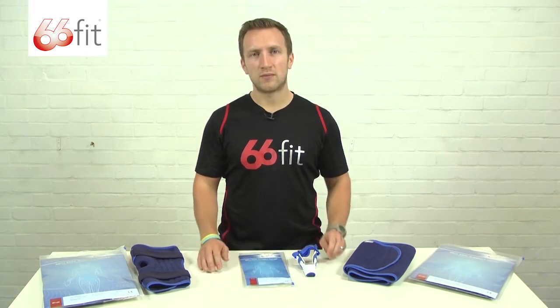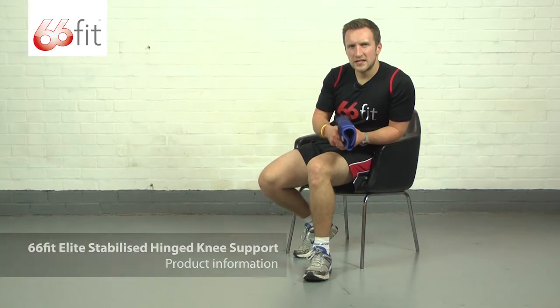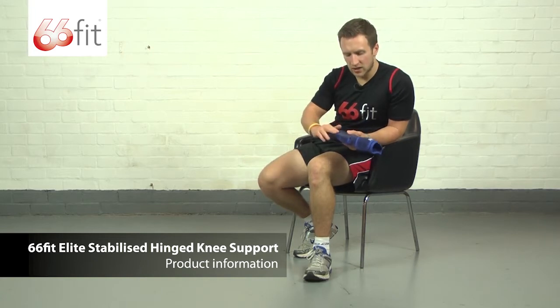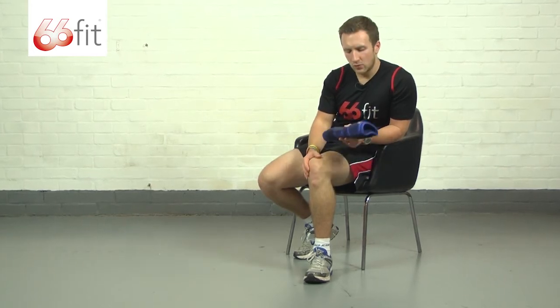I'm now going to show you in a bit more depth one of those supports. This is the 66 Fit Elite stabilised hinged knee support. It's made of a 100% breathable neoprene inner core and 100% nylon outer layer. It's nice and soft and smooth — it won't irritate your skin when you're wearing it.